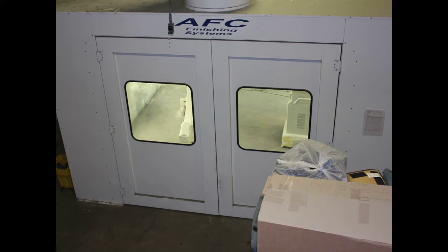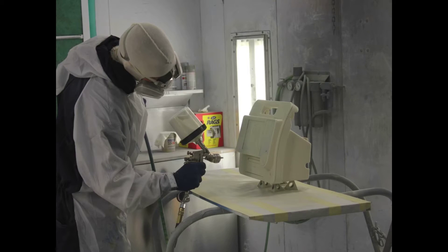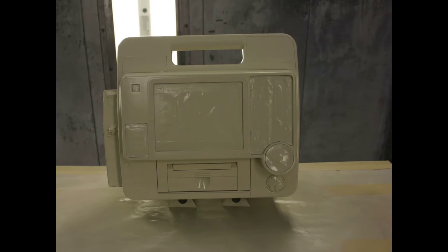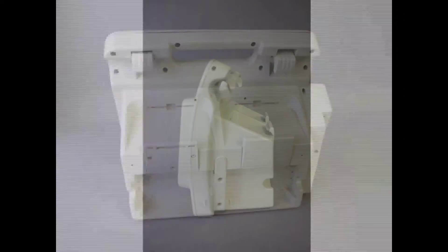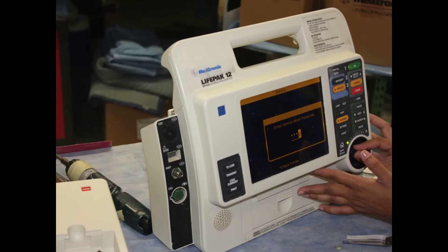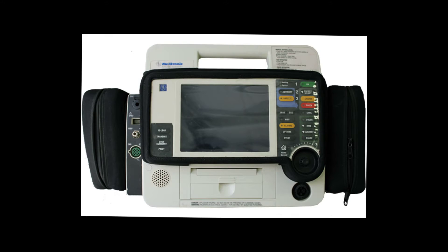Our entire process is completed on site. Painting occurs next to our quality control department. The paint is allowed to cure for 24 hours. The tape is then removed and the unit reassembled and inspected by our QC department. An engineer will come out, reassess the workings of the unit, and run another diagnostic test. Refurbishment is complete and the unit is now ready to ship.